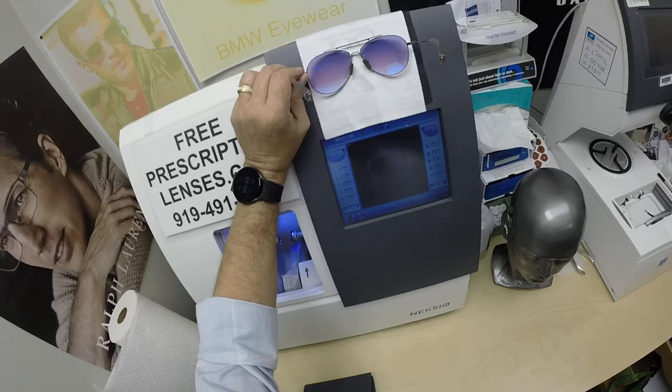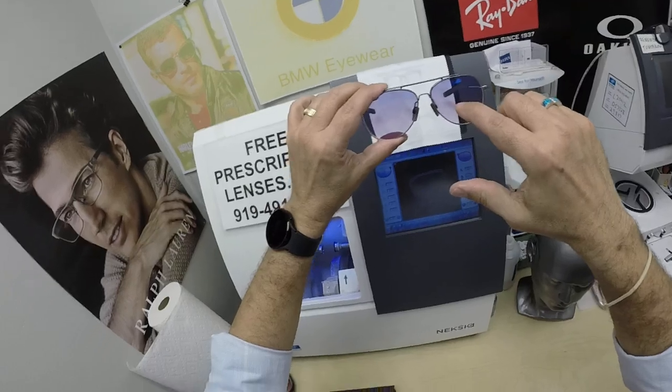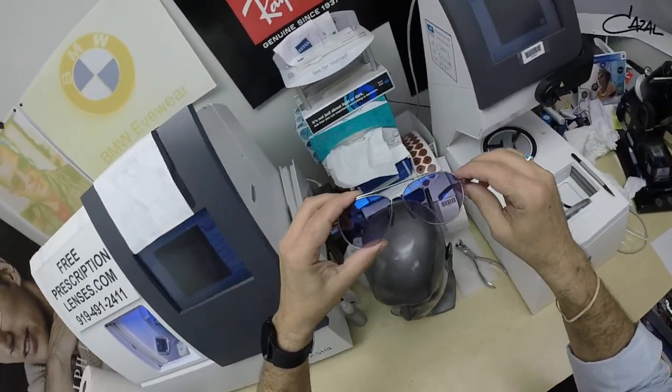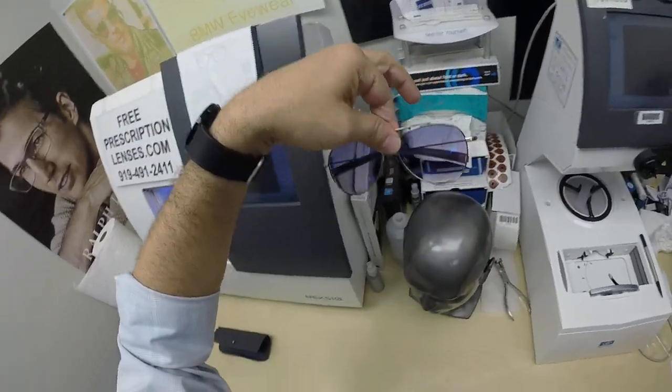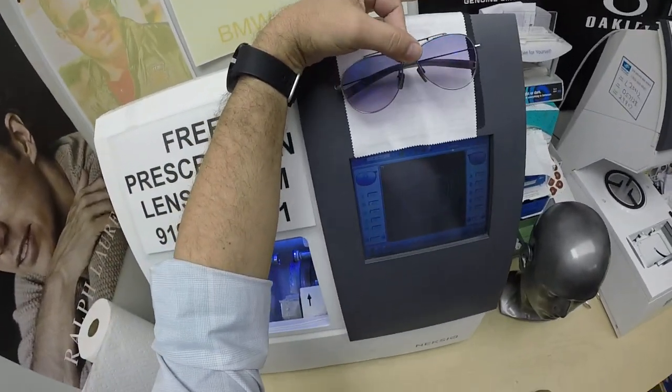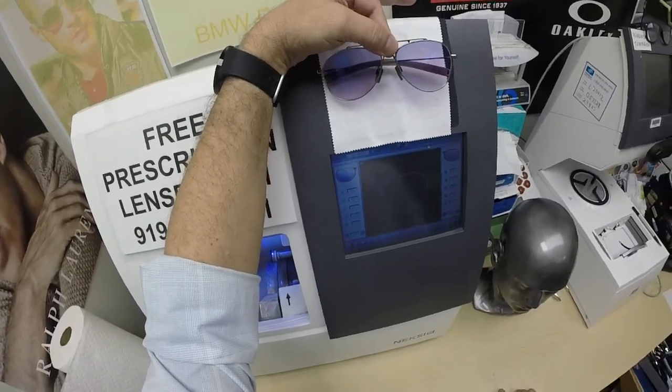Y'all have got to see this. Wait till this purple background now — the Photofusion Extra Gray with the Blue Flash Mirror. But with this purple tint on the front, the violet, the Sweet Violet — which, by the way, was my nickname in college my freshman year.